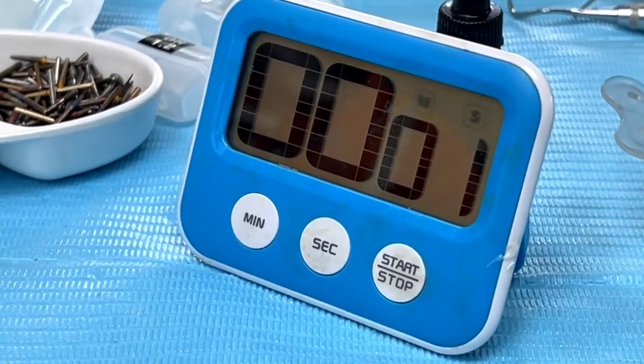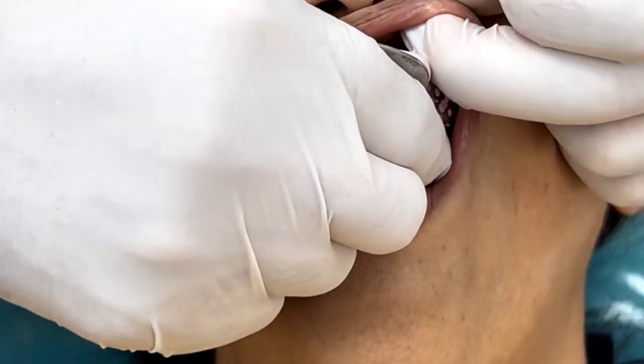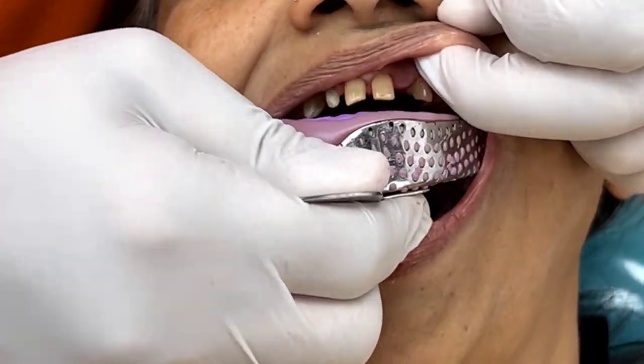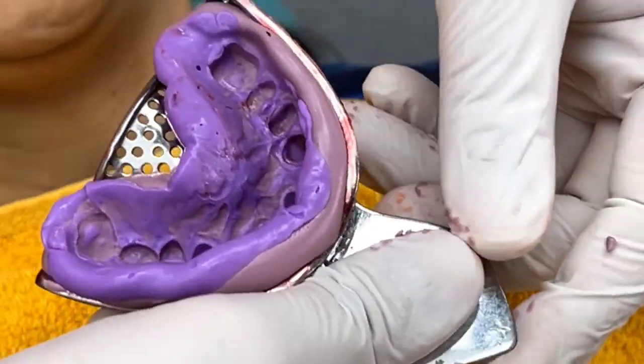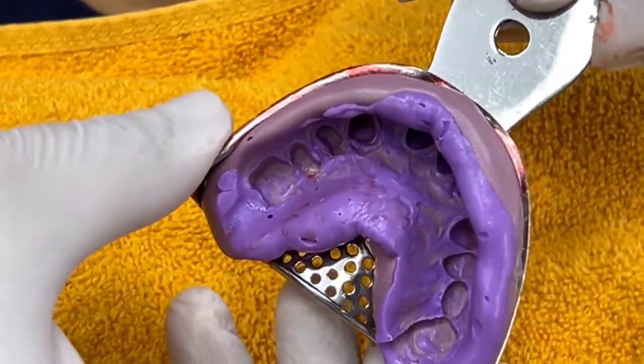I like to work with a countdown timer set at four minutes. Once the four minutes are over, the putty-loaded tray is retrieved with a snap, and here you can see an ideal impression recorded in light body.